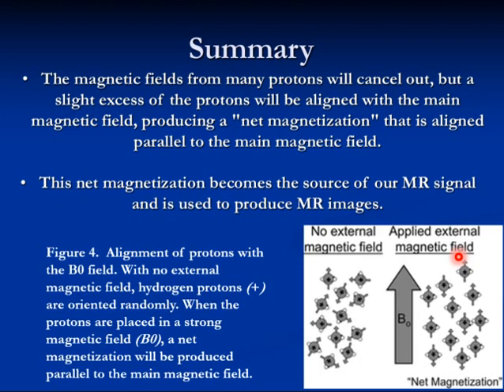The same thing. When there's no resonant frequency, the protons are talking and fighting and laughing and doing everything, and when you give the resonant frequency they will all be attentive. They will all hear what you say. You tell them turn to the left, turn to the right, go up, go down, they will say okay. So the resonant frequency is the magic. You use the magic to control the whole thing. Now we will talk more about it.